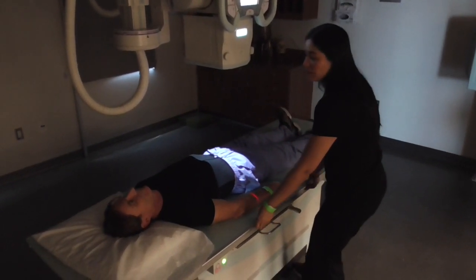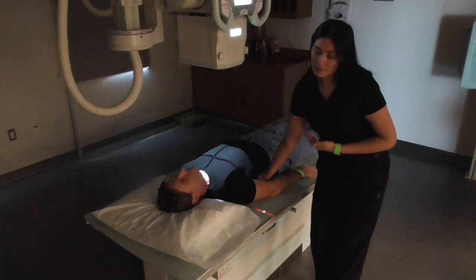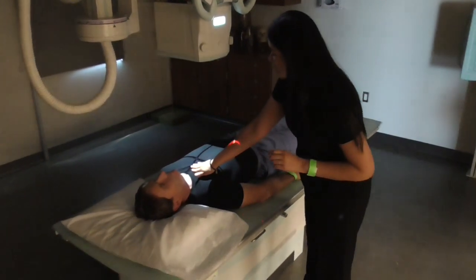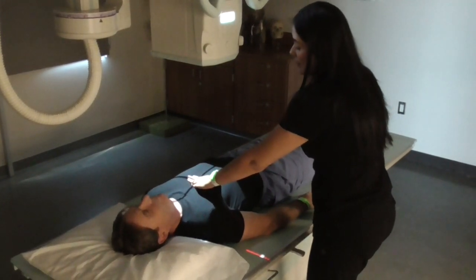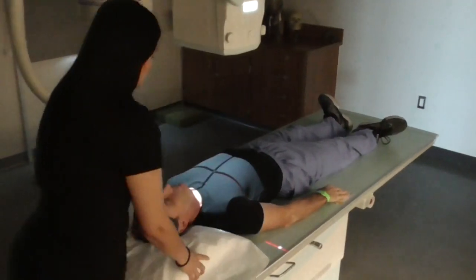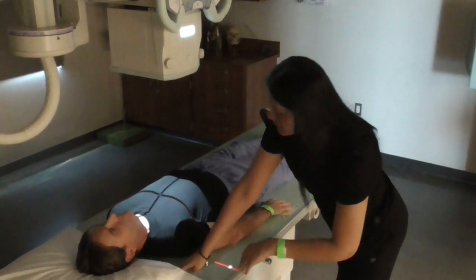also at the level of T7. But since he is facing AP, it can be hard to feel for his T7 or the inferior angle of the scapula. So here's his jugular notch and I'm going to go 3 to 4 inches distal, away from the jugular notch. You can also use, as a reference, the top of the light field 1.5 to 2 inches above the shoulder, as we can see here.